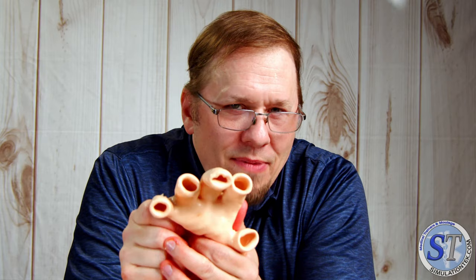Don't leave it folded over like this. I know you've got it done, you're happy, you're doing your little dance. If you keep it on here like that, it's going to cut, it's going to break, and you're out of luck. Make sure you fold it back on itself and put it back the way it's supposed to be.